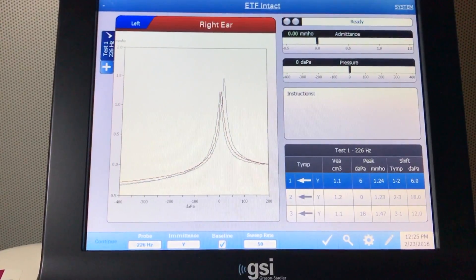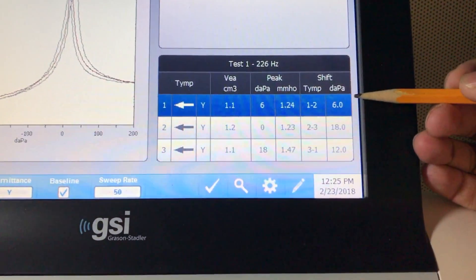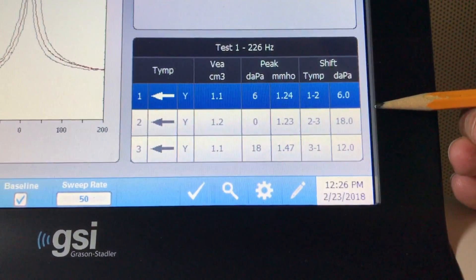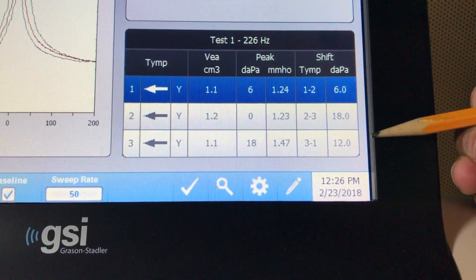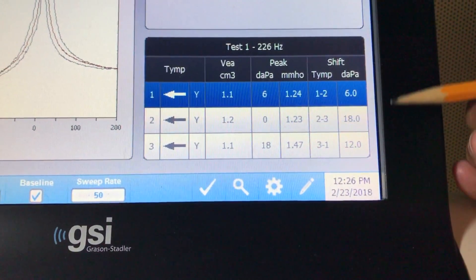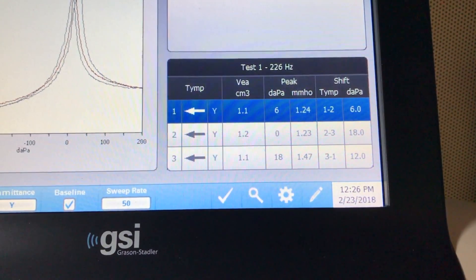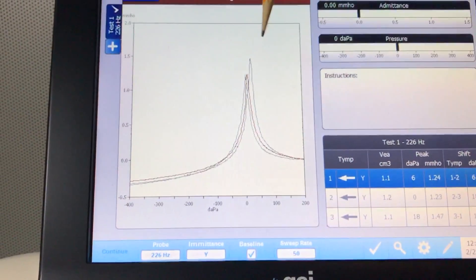Here you can see the shift in the middle ear pressure from the baseline to the second temp and the third temp. If you see a change of around 15 to 20 decapascal, that is an indication that the eustachian tube is functioning normally.